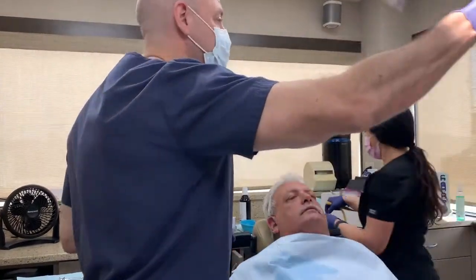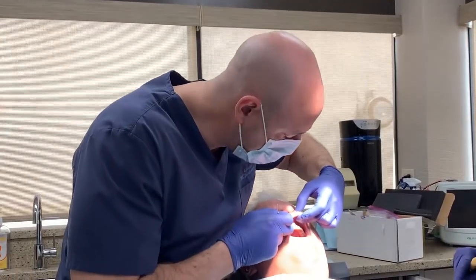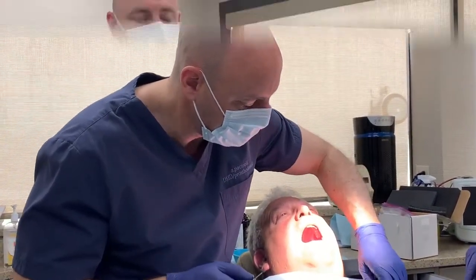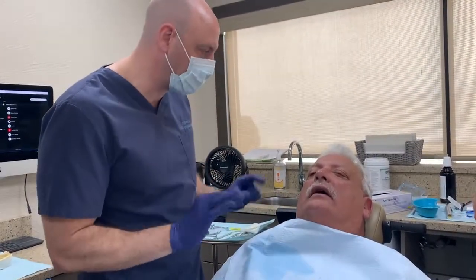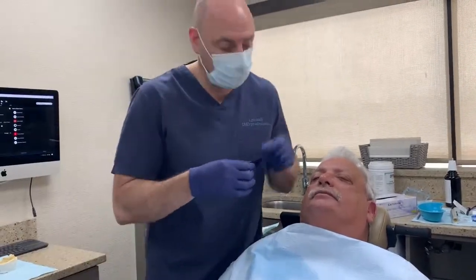All right. Now the aesthetics should be on. If you want to swap for me. I'm hurting him a little bit because it's putting a little pressure on his gingiva. So we're going to see. Jack, when you bite down, I haven't checked your bite at all with my articulating paper, but does it feel like you're hitting on both sides? Yes, it does. Okay. Feels good.